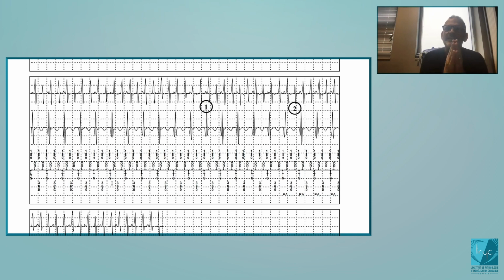If more than 75% of the cycles are in these two, it's clear? Yeah. It's going to be considered as stable. Here, it's really, really stable because 100% of the cycles are 360 milliseconds. Okay, so this is considered as stable. So at this time, it will say, okay, now, if it is stable, it cannot be atrial fibrillation, conducted atrial fibrillation. Okay, clear? So there are two remaining arrhythmia possible: conducted atrial flutter, and dual tachycardia.